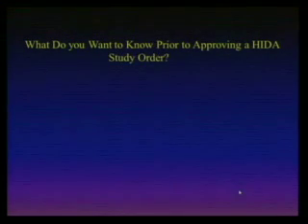So that's you. And after you ask, what's the first thing you want to ask? You say, I want to order the HIDA study. First thing you really want to know: is there any prior imaging? Why do you want to know the prior imaging? Is there an ultrasound already? What do you want to know from the ultrasound? Is there a gallbladder? Yeah. So that's the first thing you want to know, because a HIDA study could be for checking the gallbladder, or it could be for a bile leak. And so that's a different thing.